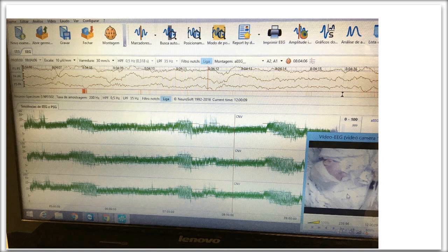I think because they're so elevated that you've gotten yourself above the 10. And once you're over 10, so the question was the sleep-wake cycling, it doesn't look like the typical widening, but I think it's because the margins are starting above 10 to start with, that when you start to see that, remembering that over 10 it becomes logarithmic, there's just so much more compression. And so even though he's doing nice sleep cycling, it doesn't look very wide because the way that the graphing is standard.